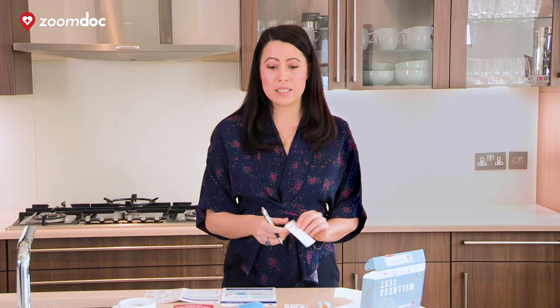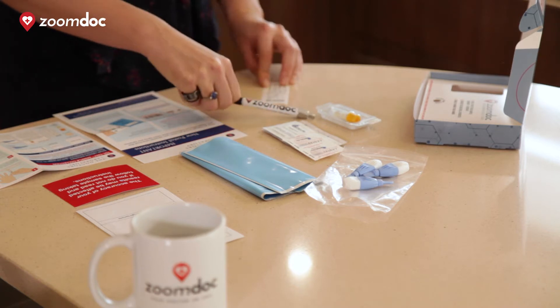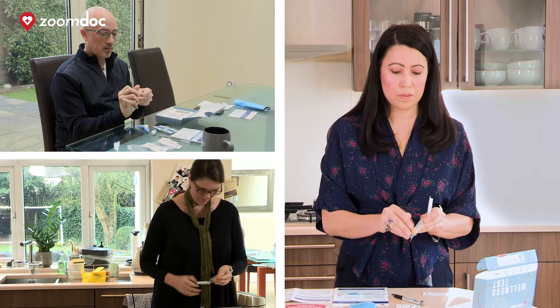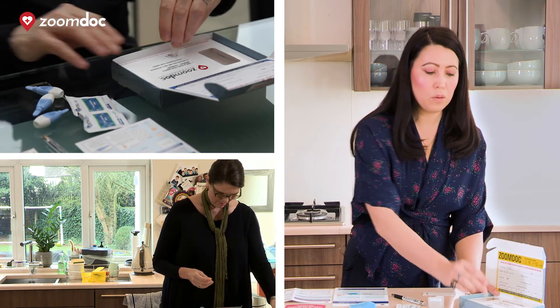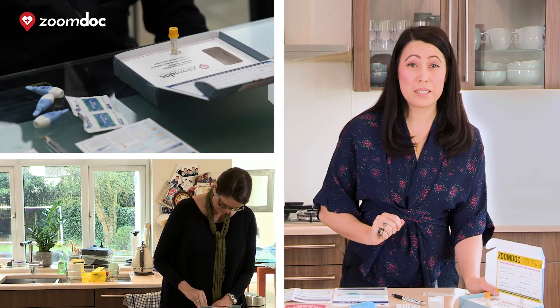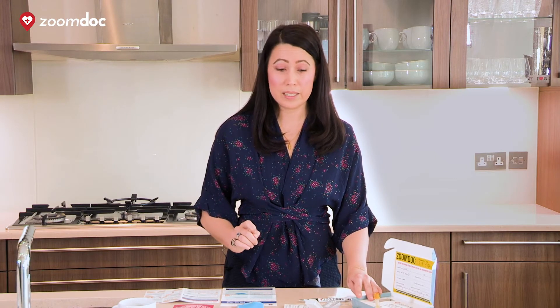Before you get started, please complete the label that's going to go on your blood sample. The next step is getting the blood vial ready — open it up. It fits in perfectly with the cylinder hole in the packet and that's to keep it steady. Don't quite open it yet as we'll open it just before the blood test.